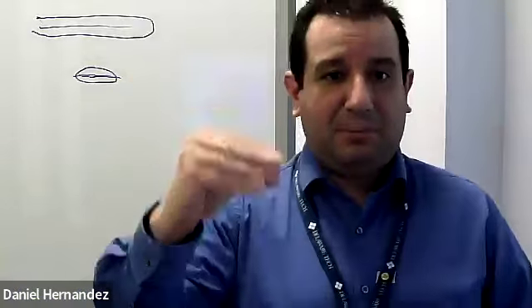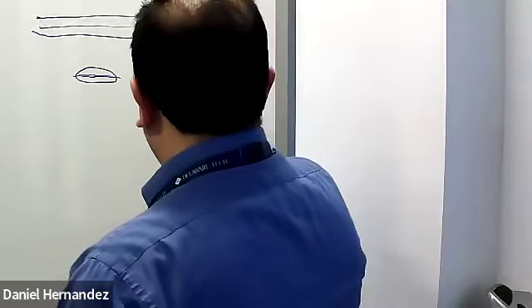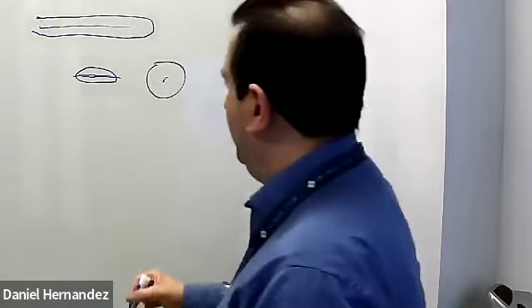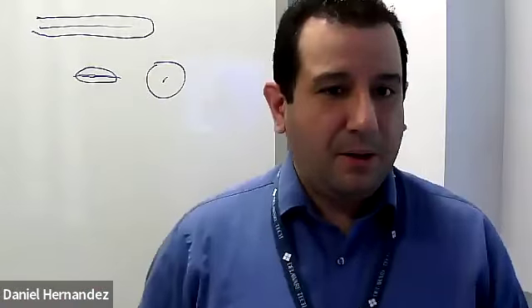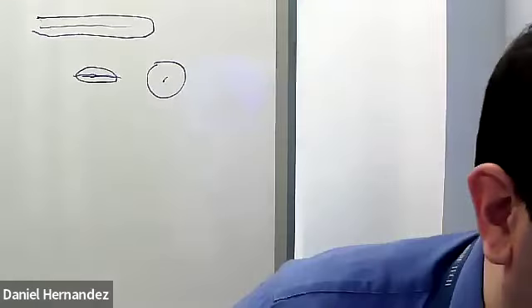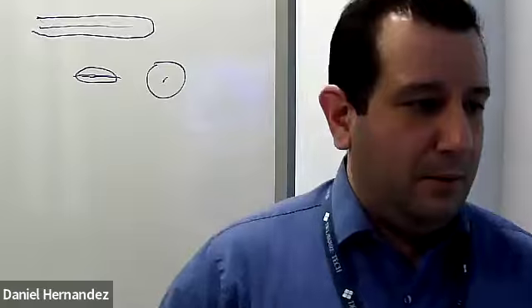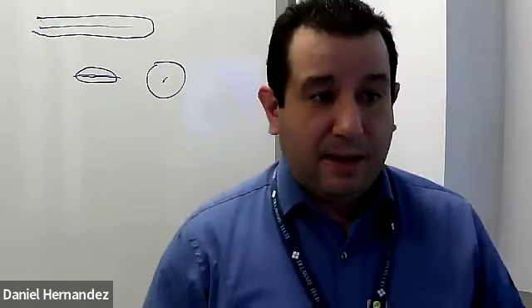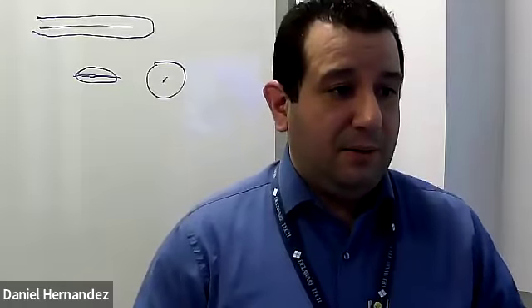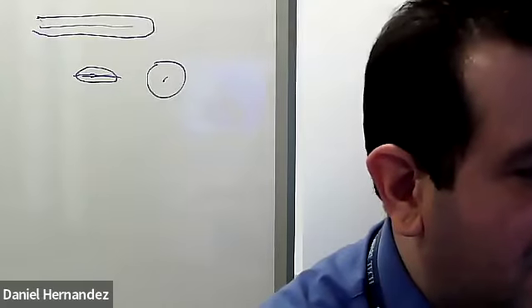And it's because it was actually decompressed. So when it ruptures, it goes from that nice circle appearance to something that looks like a flat tire almost. Like it wants to elongate, but it doesn't quite. So that's a sign that this appendix is probably ruptured. Again, we look for any localized, well-defined right lower quadrant abscess formation to indicate that this appendix is potentially ruptured.